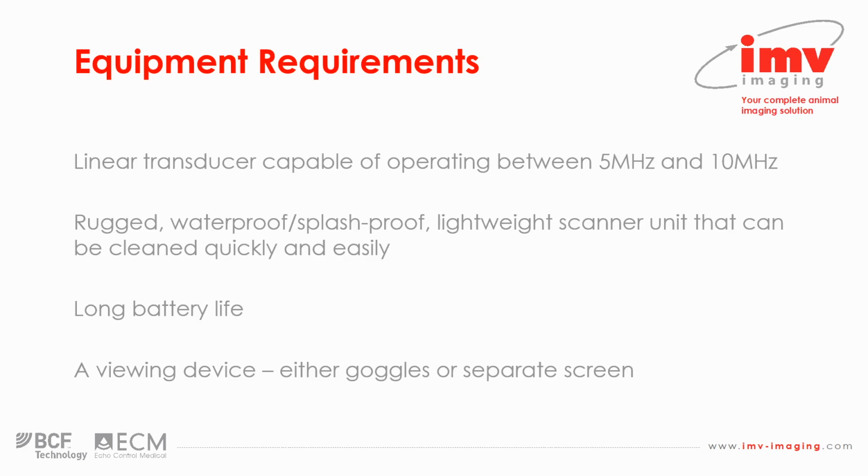There are several products available now, which, as you saw earlier with my discussion of the history of ultrasound, have dramatically improved the lot of the farm vet having to carry the equipment around and use it for extended periods of time without getting backache or what have you, and being able to use that equipment on farm without batteries running out.